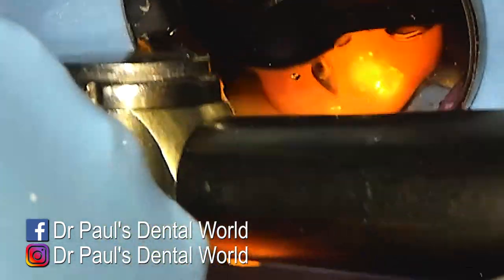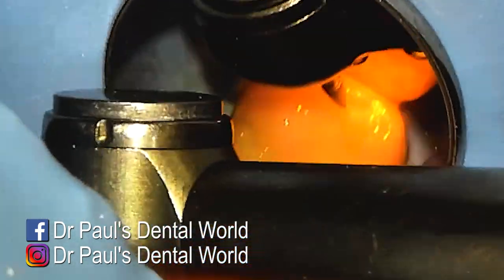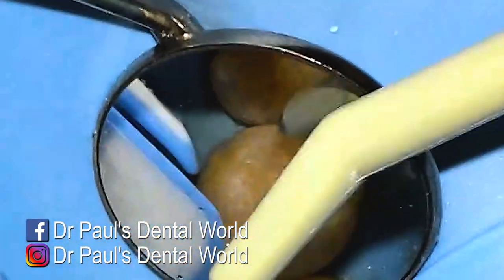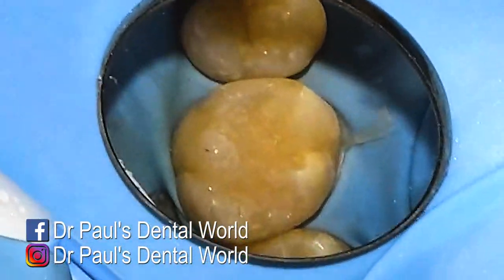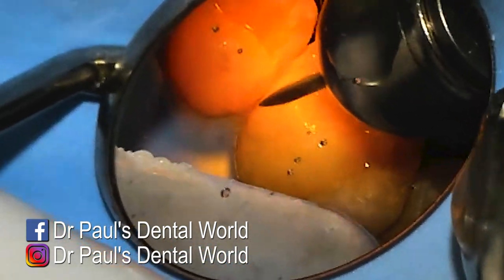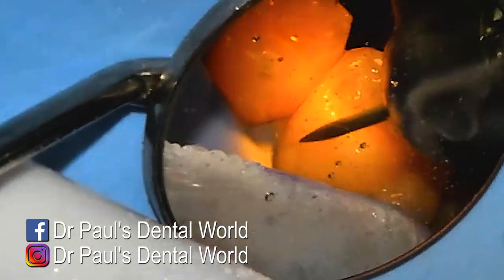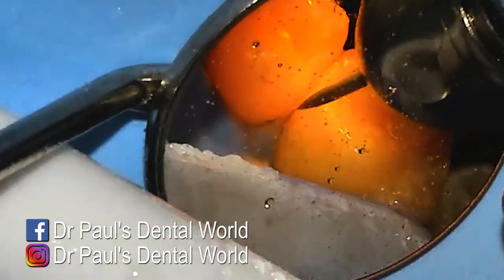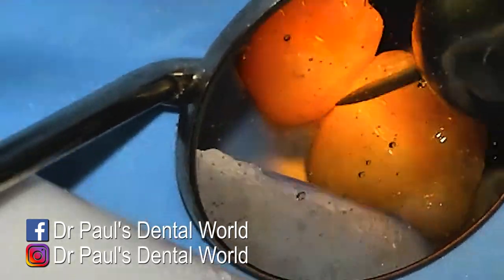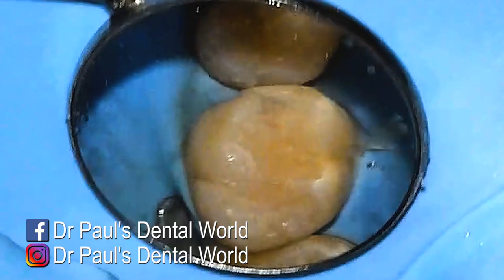The better I have the anatomy in this phase, the less adjustments I'll have to do once I take the rubber dam off to check the bite. Do you have to shape anatomy into your fillings? No — I know a lot of dentists that will just basically flatten things off. But I like to do it because most importantly, this is how the tooth was designed — with bumps and grooves to help the patient chew and to make the teeth more effective.